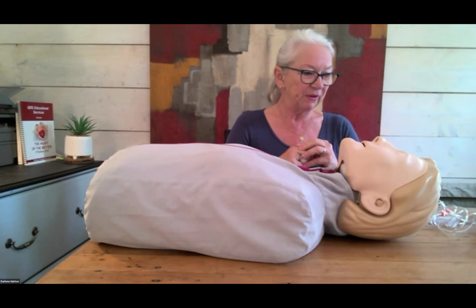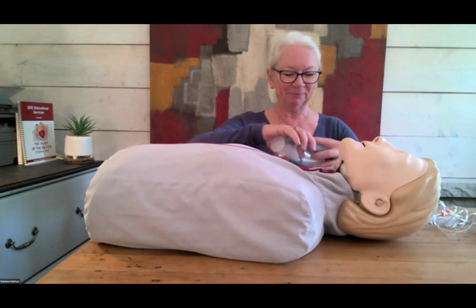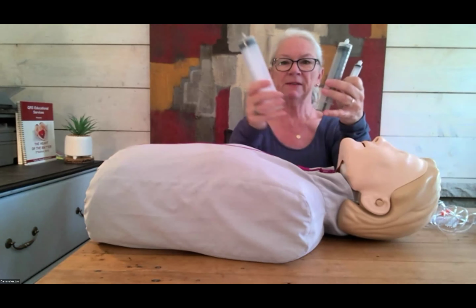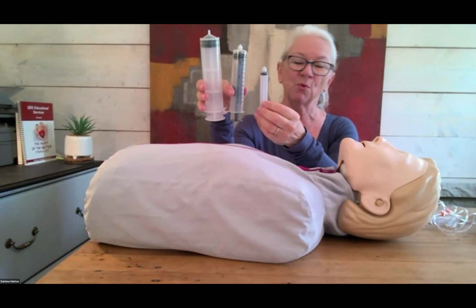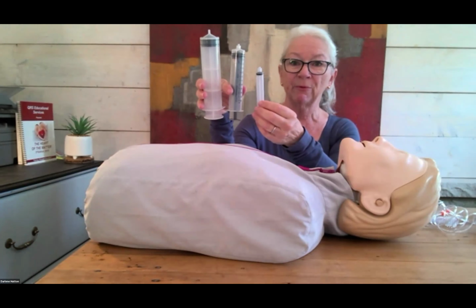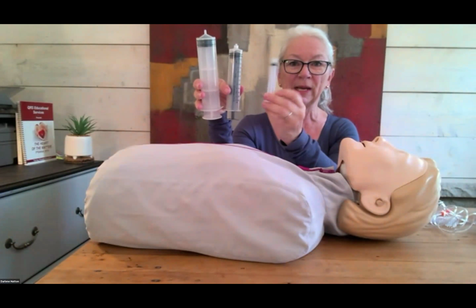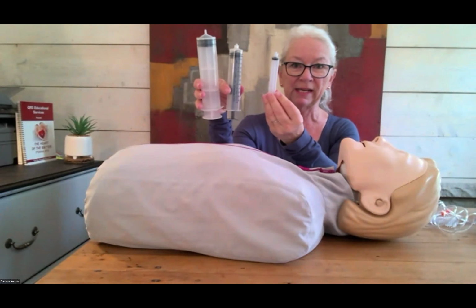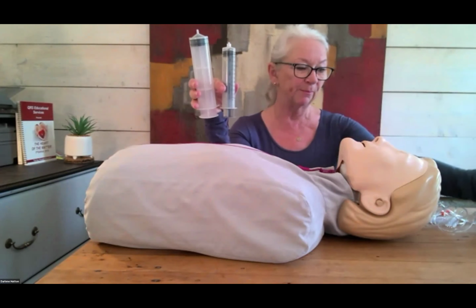So let's just review the 5 S's and syringes. Right, I knew I'd forgotten some S's. So we've got 3 different size syringes that will be on your airway cart or your crash cart for the airway management section. The smallest syringe here is good when intubating with an endotracheal tube. So you'll need that one only for endotracheal intubation.